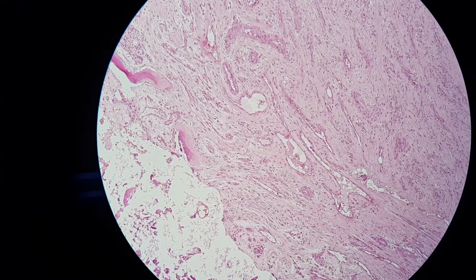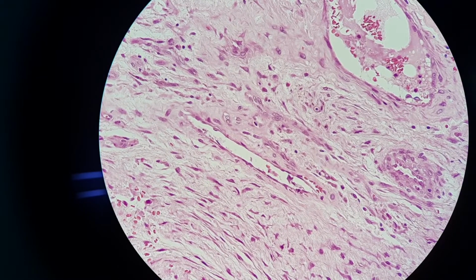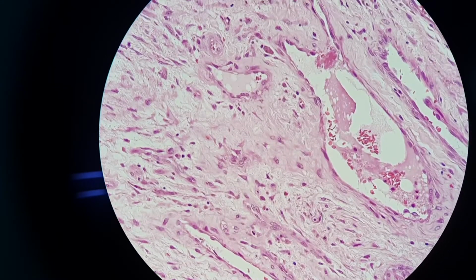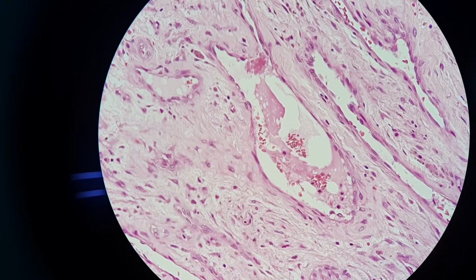Fibrosis is just an increase in the number of fibroblasts and also fibrocytes. You can see there are spindle cells with elongated, hyperchromatic nuclei, arranged in long fascicles with a lot of vessels, small capillaries or small arterioles, within the fibrotic tissue here. You can see there are still red blood cells to help you identify the vessels.